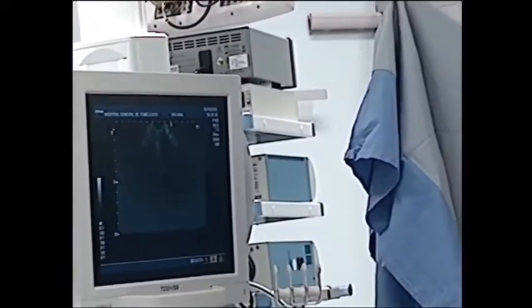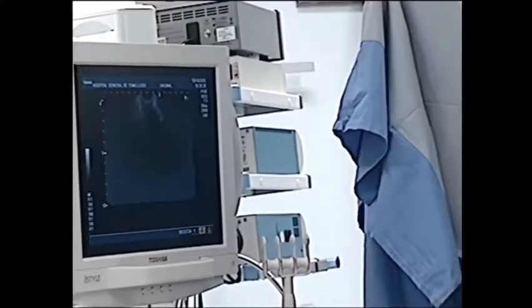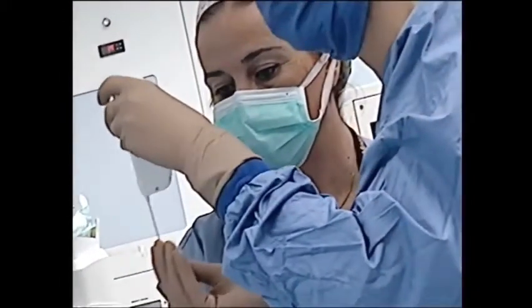Today we have seen in the summary video the didactic recording of a single sample. Dr. Marti Brenas continued with the extraction of several prostate fragments, and we want to thank his collaboration and his team for the making of this video.